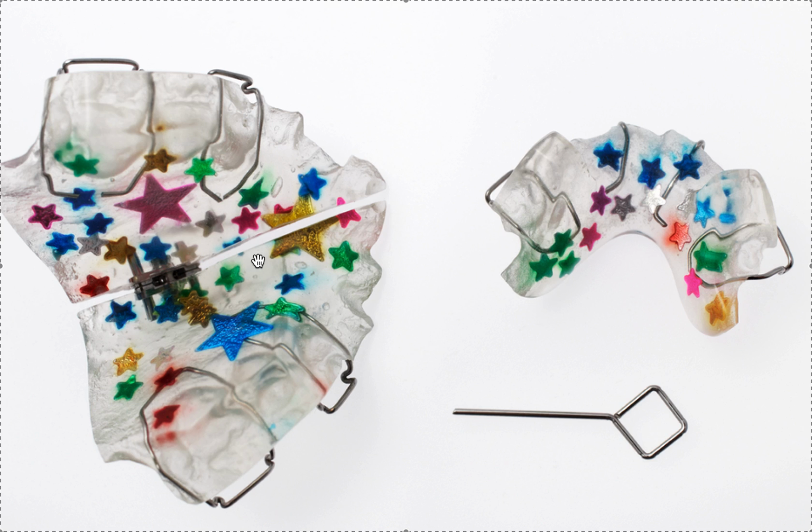You're still going to need to do some type of braces or aligners at the end just to fine tune things, but it's really nice in the mixed dentition when you can expand the arches, because often when you make the space, they come in kind of straight to begin with, okay? And sometimes you get lucky and you never even need to do phase 2 braces or aligners. That's pretty rare, but at least it's a lot easier than it was.